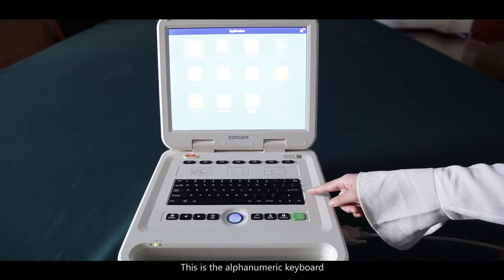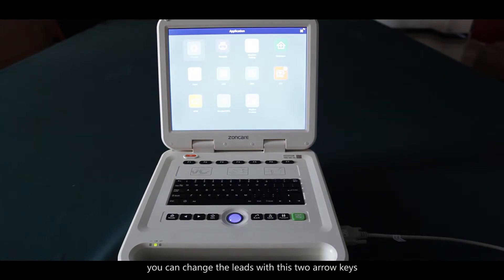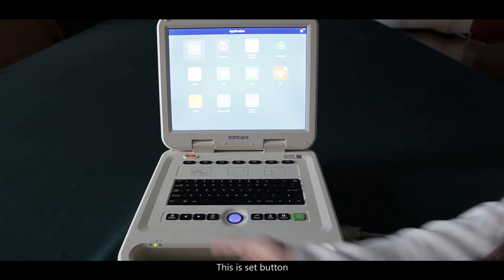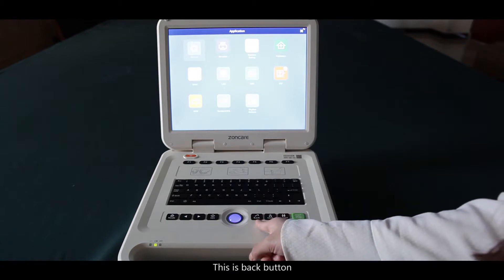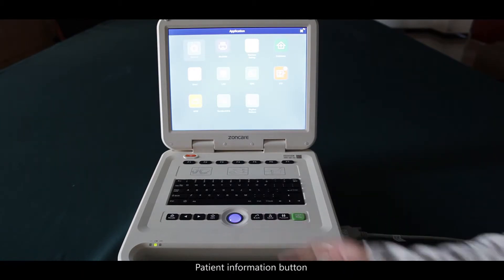This is the numeric keyboard. This is the mode key — you can choose manual or auto mode. If you choose manual mode, you can change the leads with the two arrow keys. This is the set button, this is the trackball mouse, this is the back button, the save button, and the patient information button.